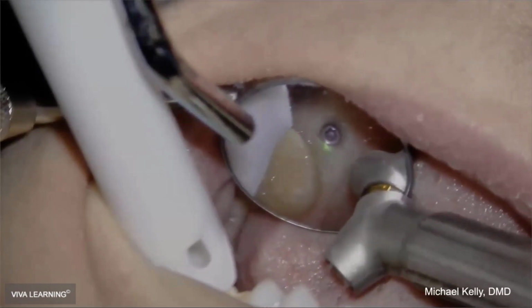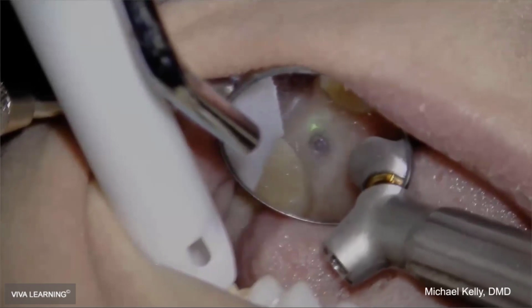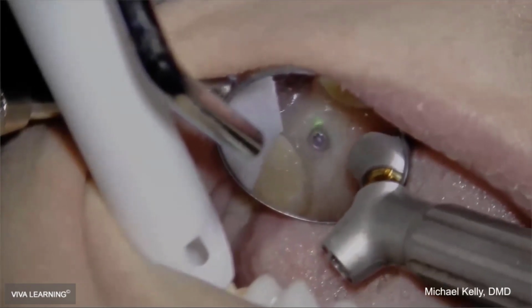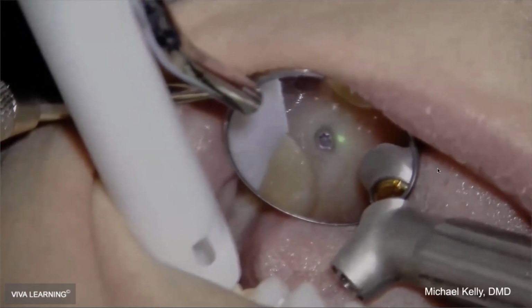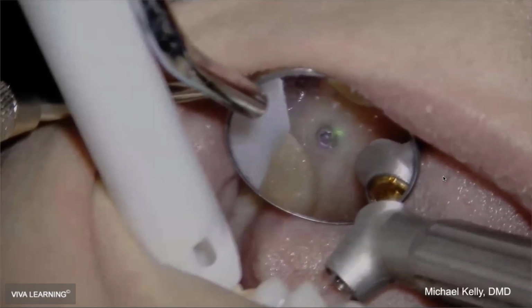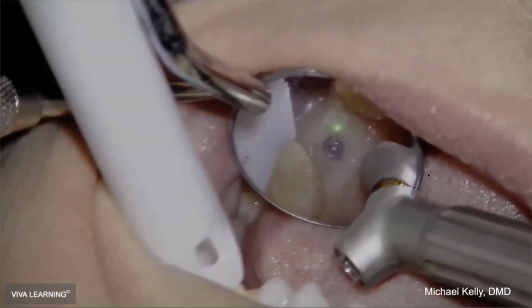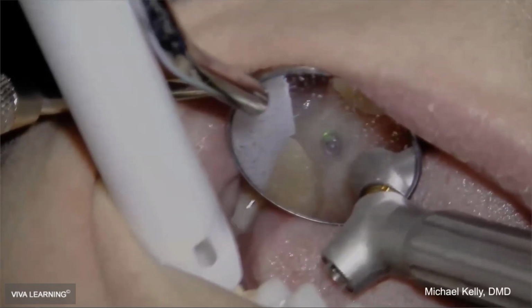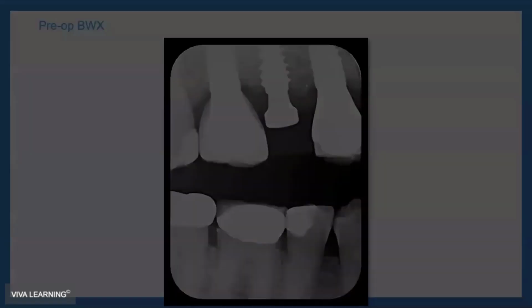But again, this is real-time video. It takes 15, 20 seconds to even visualize the implant, and then you can spend as much time as you want contouring. But this is, in my mind, a lot more predictable than cutting this with the scalpel blade and getting bleeding and then having to place a healing abutment and coming back and placing a crown later. So we're going to focus more on this emergence profile concept.